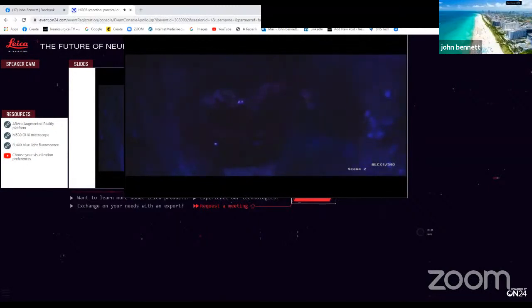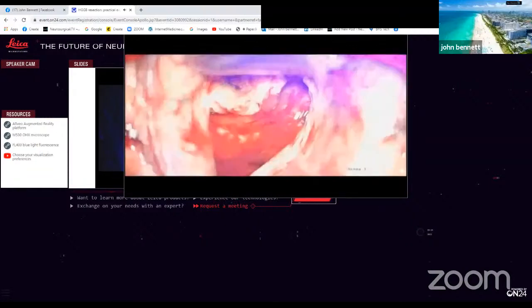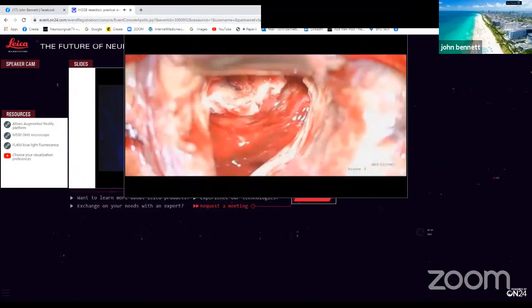This will then allow you to also search around the tumor margin for any areas where there might be a small area of fluorescence that might indicate tumor cells or tumor infiltration within the tumor penumbra. This is once again very important, as we know that the amount of tumor resection greatly affects your patient's long-term survival, and we all aim for a 95% tumor resection.